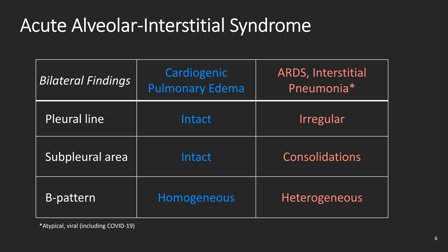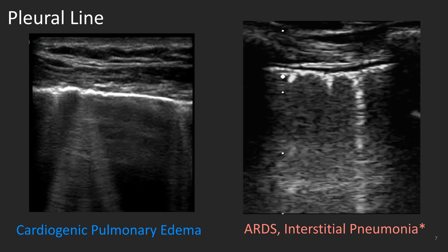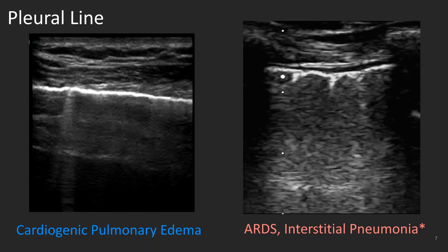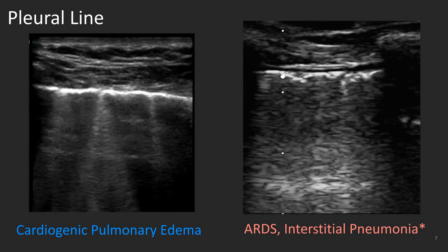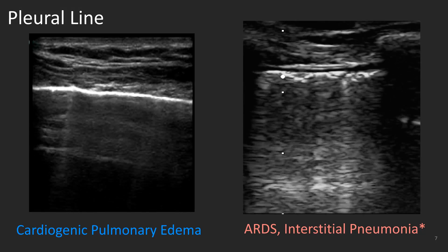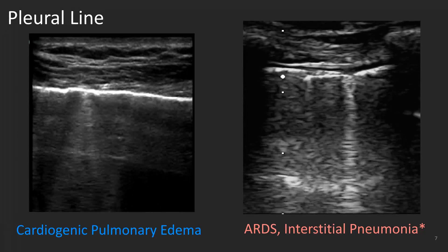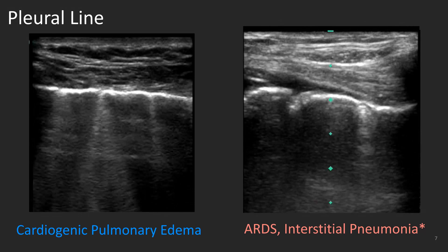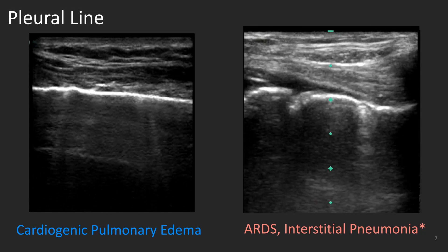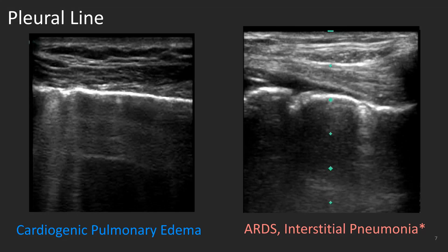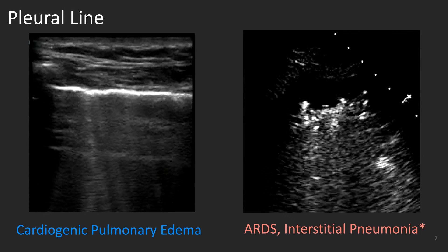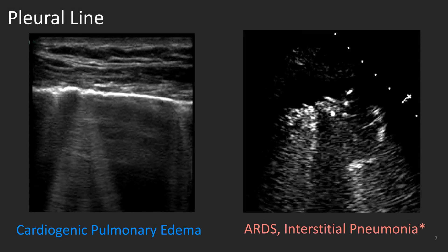Let's start with the pleural line. Here we see 2D images with a linear probe. On the left we can see a nice intact pleural line, while on the right the pleural line looks irregular and ugly — it is not a nice horizontal line anymore. Another example of an irregular pleural line is shown here; this one looks ragged and not very linear. The last one is even worse, where the pleural line is completely disrupted — choppy and irregular.